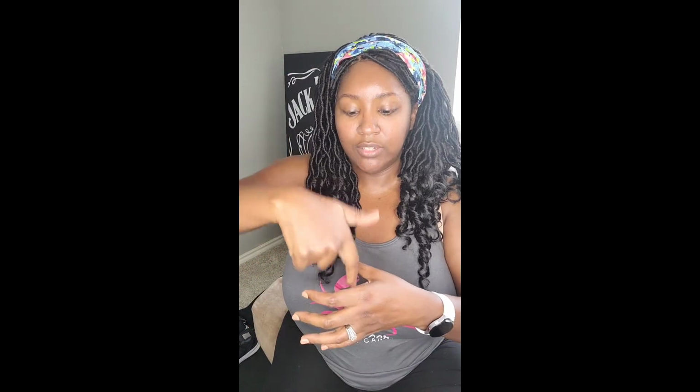You get some numbing medication that they put on the top, and then they put it down a little bit deeper. I couldn't feel everything, but they talked about how you'll feel pressure. I felt almost like they were hitting a nerve the first time, because the deeper they went, I could feel the discomfort and the pain radiating all the way around to my back. It was quite painful, but they stick the needle down into your breast, and then they use the machine to take an x-ray to see if it's where it needs to go. If it is, then they inject the SAVI SCOUT and take out the needle. So you have to sit there while they're doing that, and you have this needle in your breast.